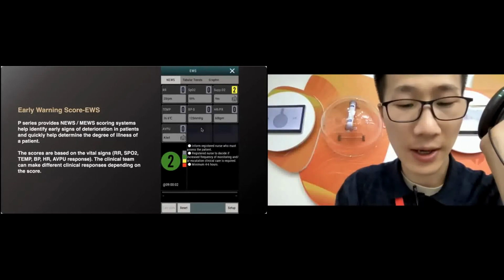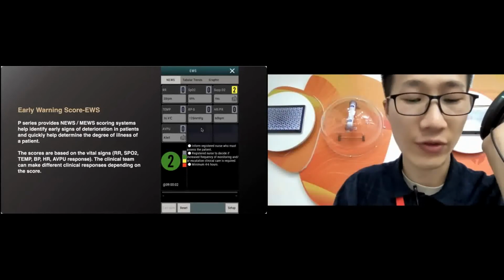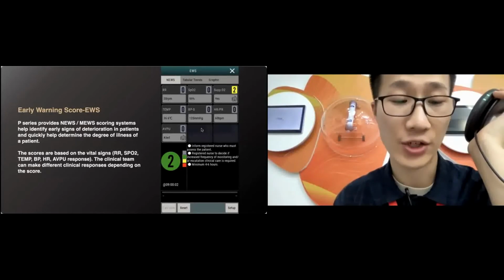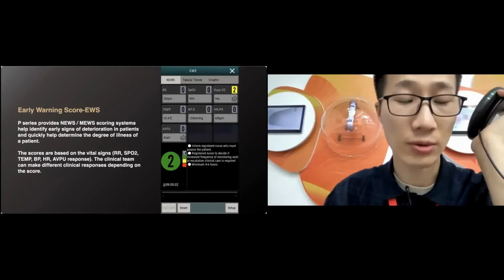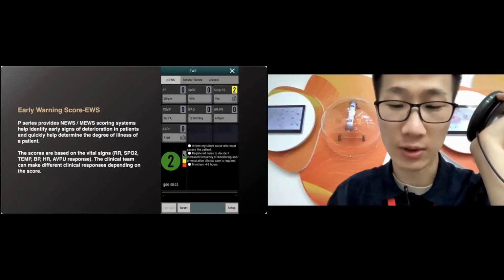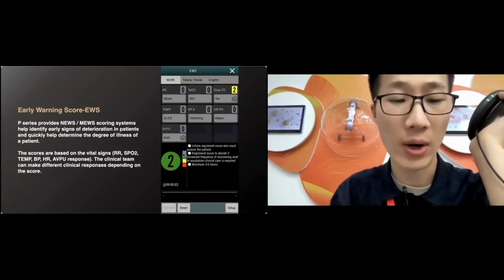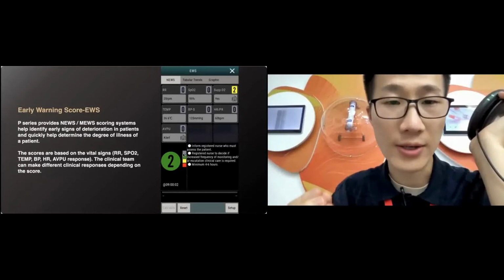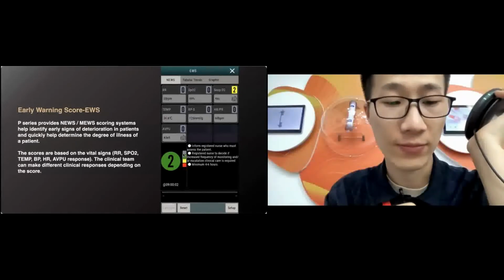And based on the alarm, if I have one-to-one care in front of a patient, I'm able to manage just one patient. But with 5 or 10 patients to take care of, how am I going to check the screen, go to each patient and check the parameters one by one? So I need a score that helps me summarize all those patient conditions in one score.